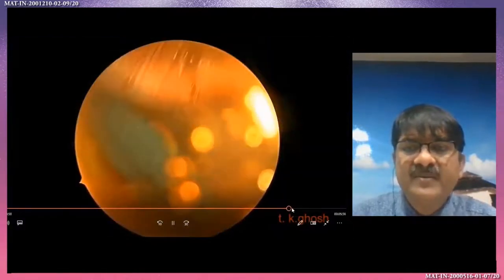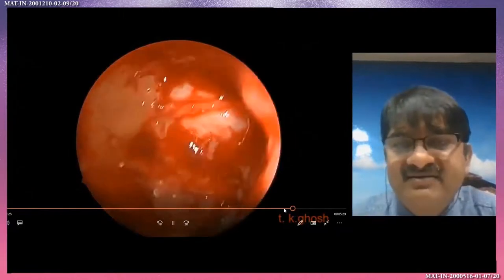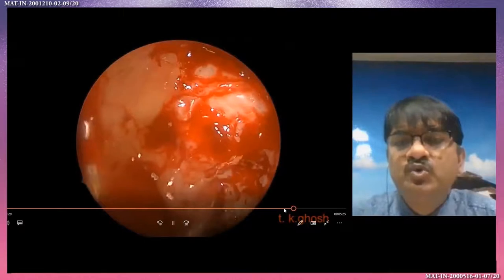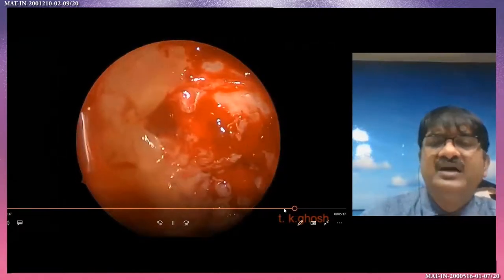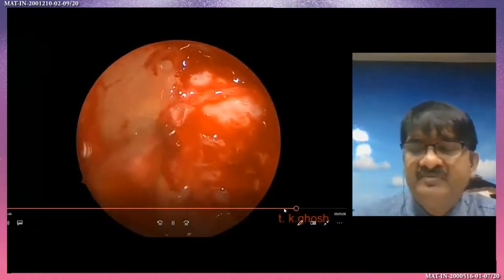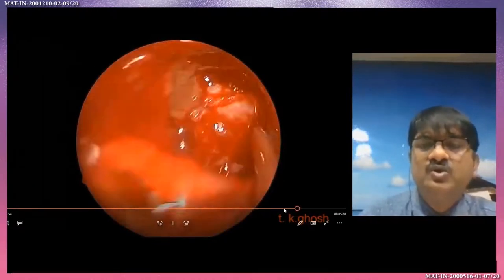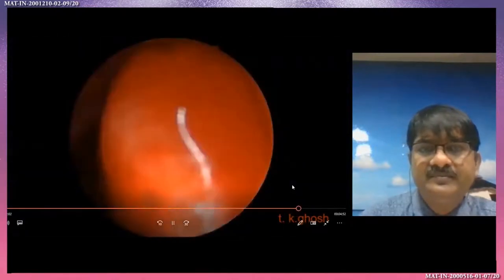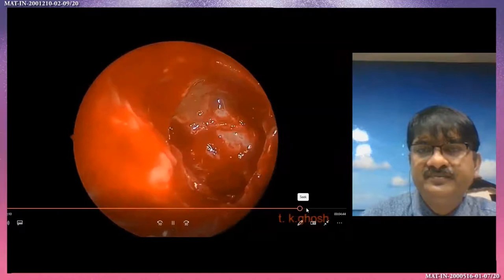Skull base is seen. Now the interesting part is the anterior part of the maxillary antrum — the anterior and lateral part is very difficult. I have one instrument: the 120-degree rotating forceps. I am using this to remove the polyp from that part; otherwise the 120-degree rotating microdebrider is also used. So at that time you need 120-degree rotating forceps. All clear.